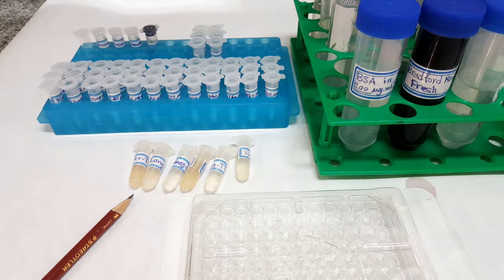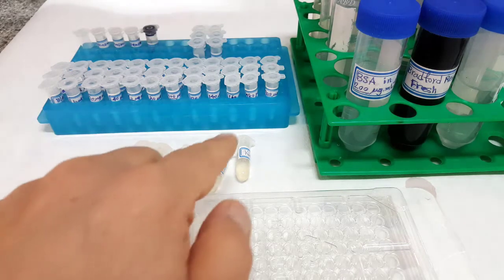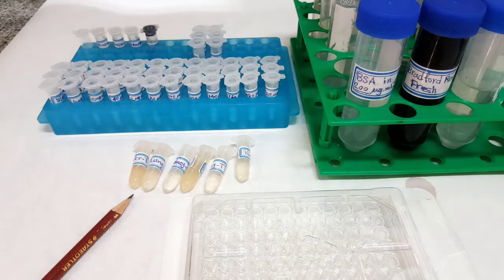Liver, lungs, and kidneys samples of Wistar rat were used. A 217 grams male healthy Wistar rat was selected. Liver, lungs, and kidneys were removed from ether-anesthetized rat by surgical operation.